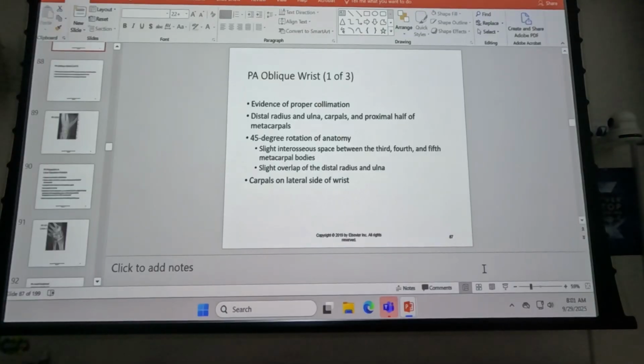There's one for carpal bridge, we're not going to cover it. Carpal canal, we're not going to cover it. If we don't talk about them either in here or in the lab, don't waste time on them. Amy will cover those in your sophomore year. But we do need to talk about some specialty views of the wrist.